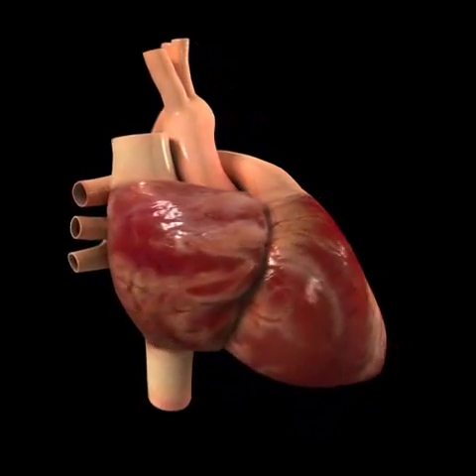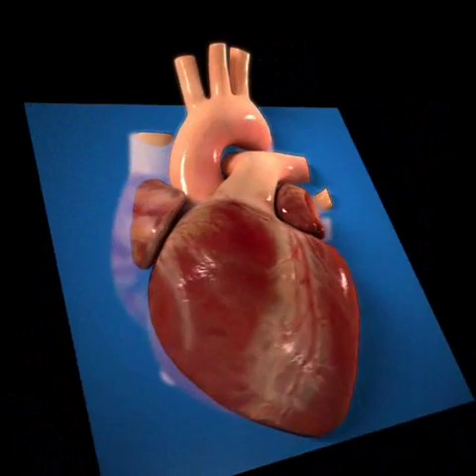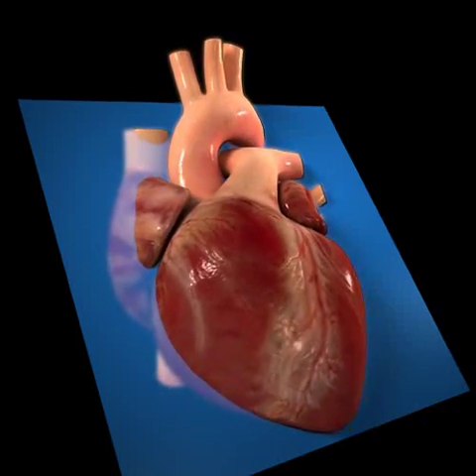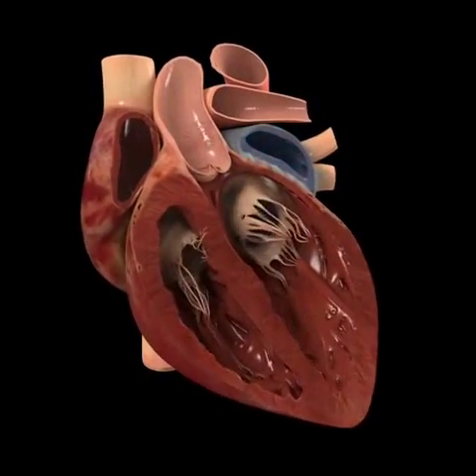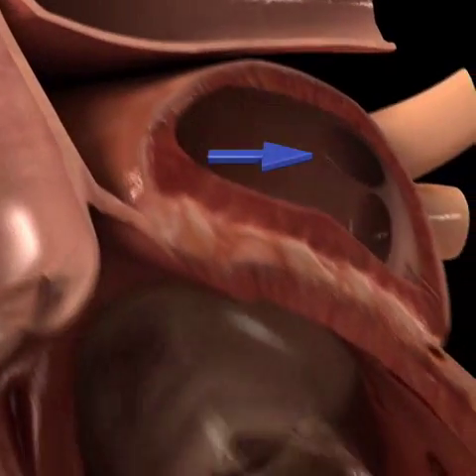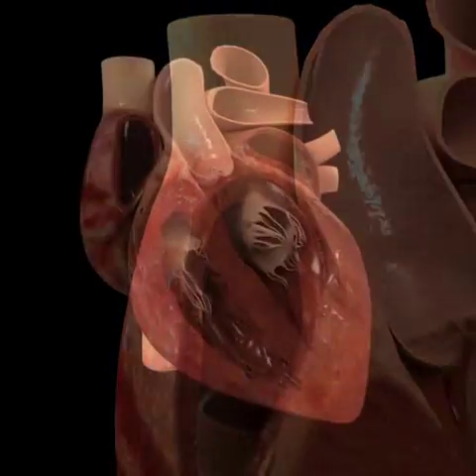The apical view sections the heart from its base to its apex in a right-left view, through the obtuse and acute margins of the left and right ventricles respectively, as well as its corresponding atriums. We can see the left atrium from its upper inferior dimension, as well as the opening of the left superior pulmonary vein and the left inferior pulmonary vein. The inferior vena cava ends up in the right atrium.